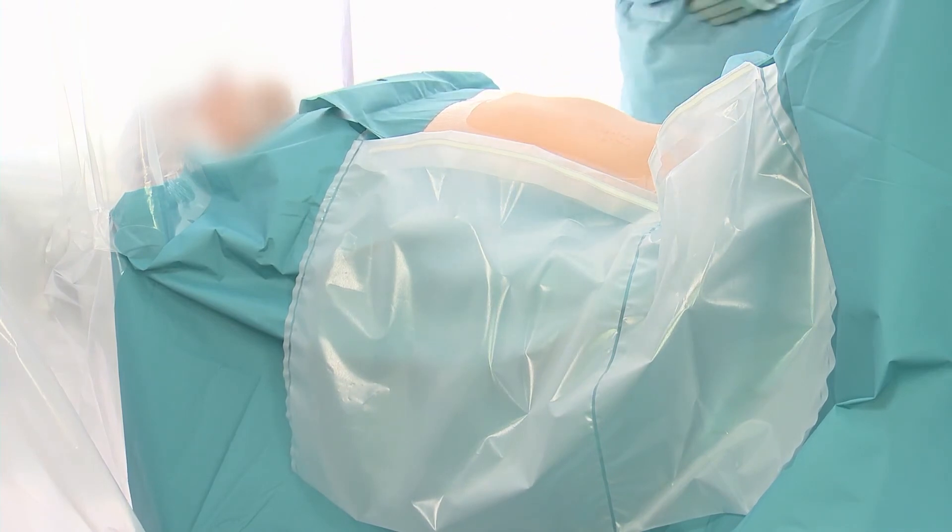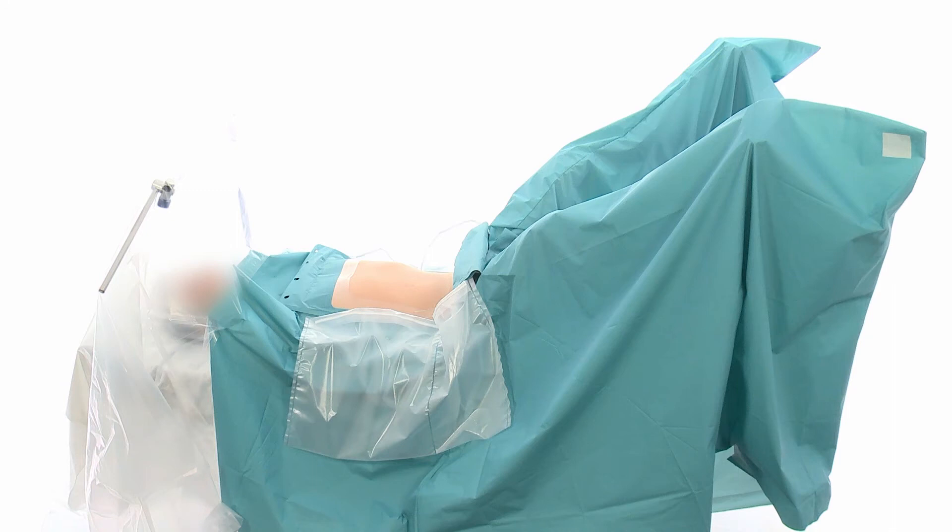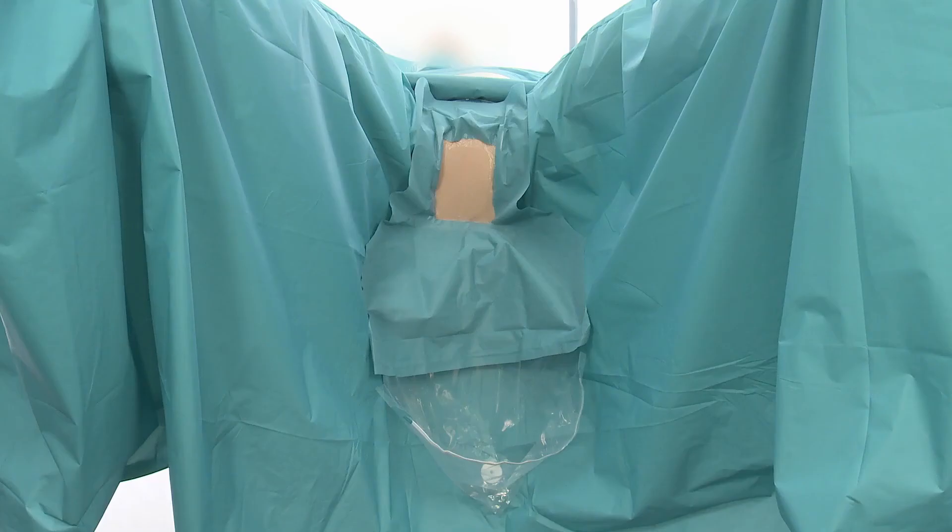The drape also features special designs more suited for robotic-managed interventions, such as a clear anesthesia screen to clearly see the patient during the intervention. The anesthesia section is extra long to cover the patient if in the Trendelenburg position. Additional features include a narrower gap between the abdominal and perineal apertures, and a barrier flex seal around the aperture of the perineal drape and the abdominal aperture.